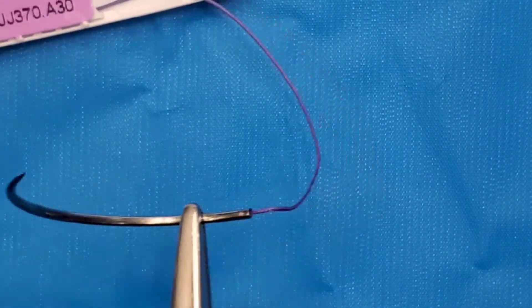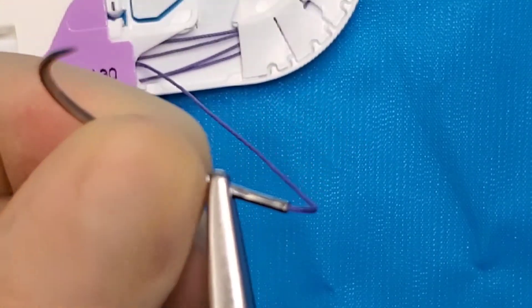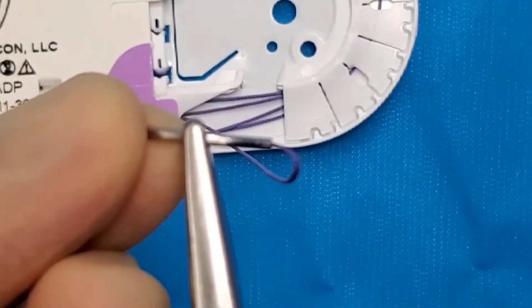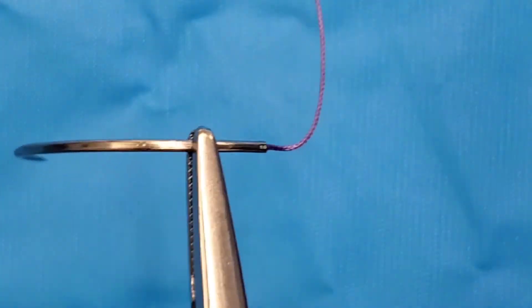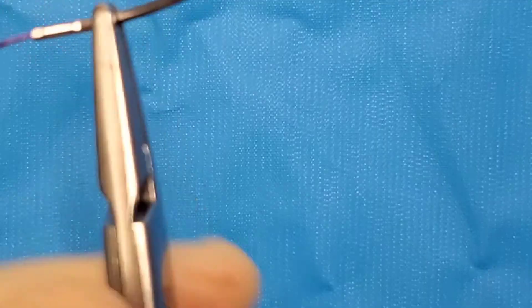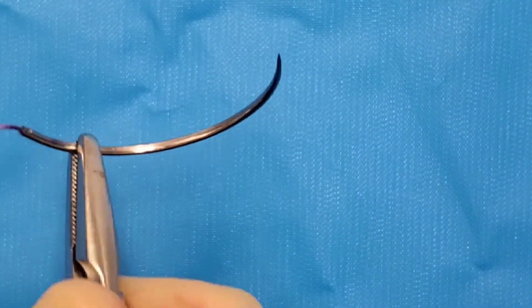Now to make it a lefty, all you need to do is flip it. Did you guys see that? Boom. And now adjust. Done. This is a lefty.